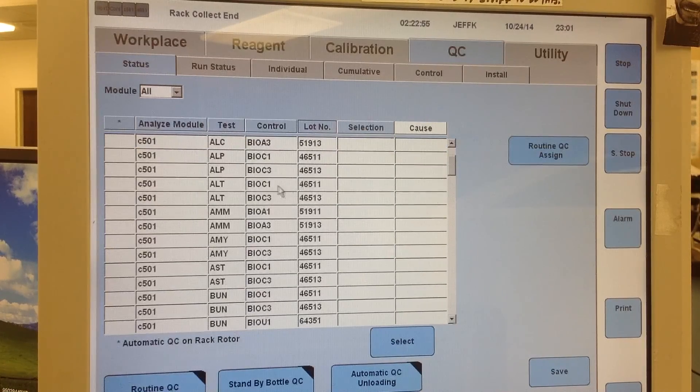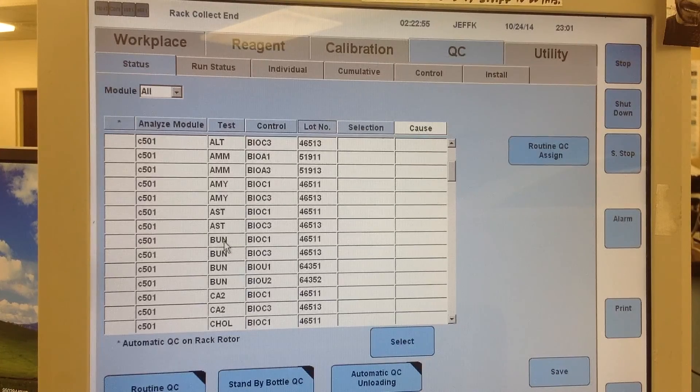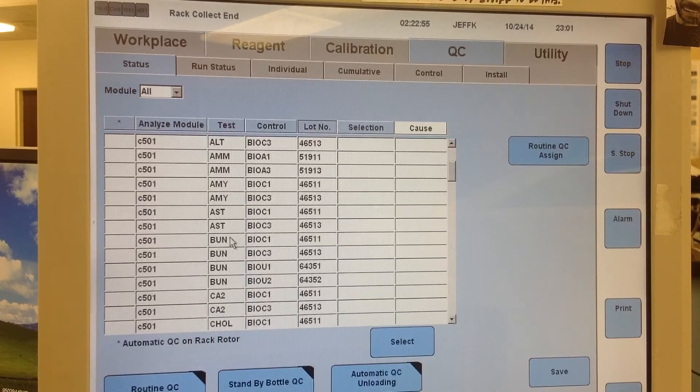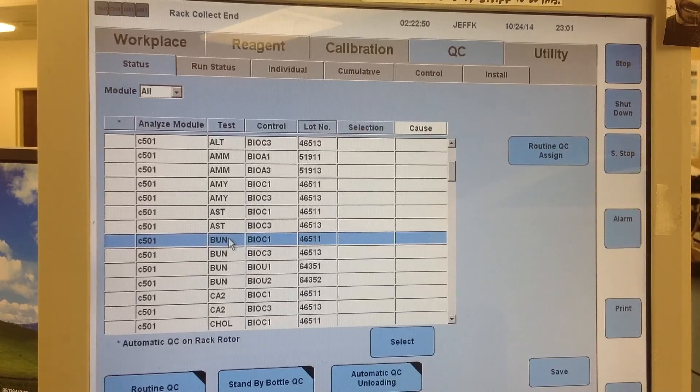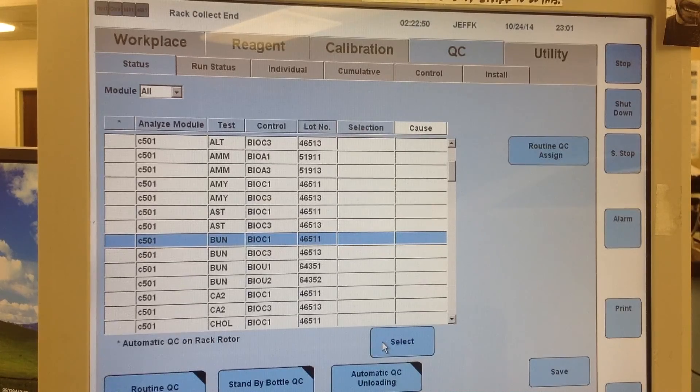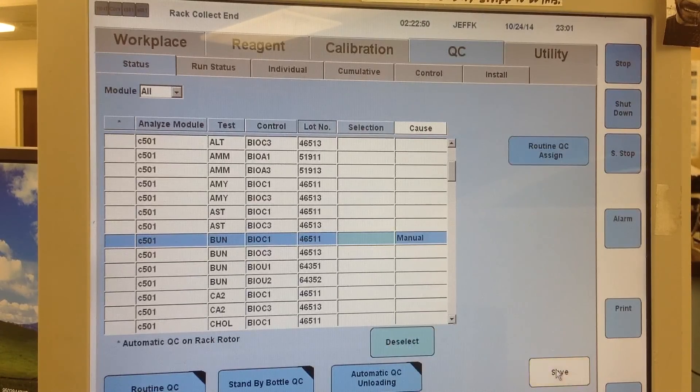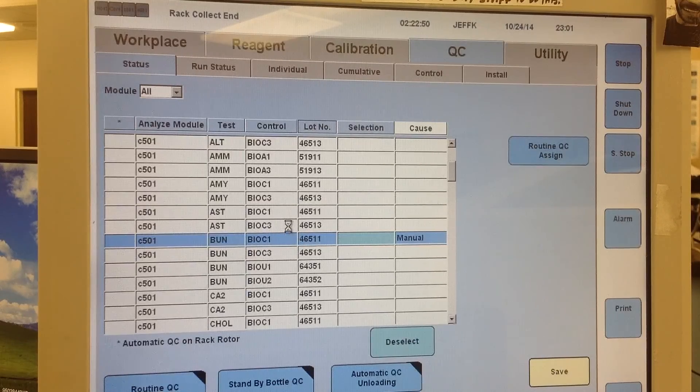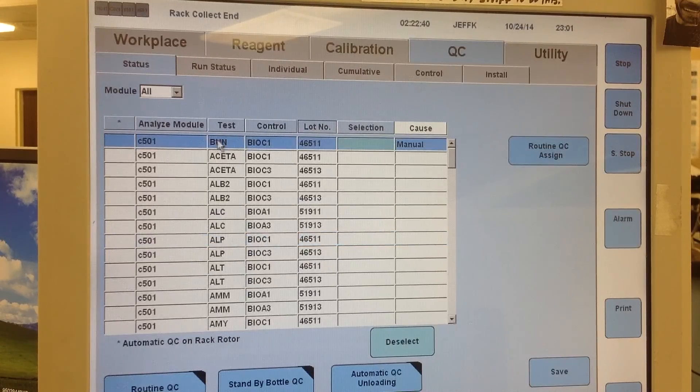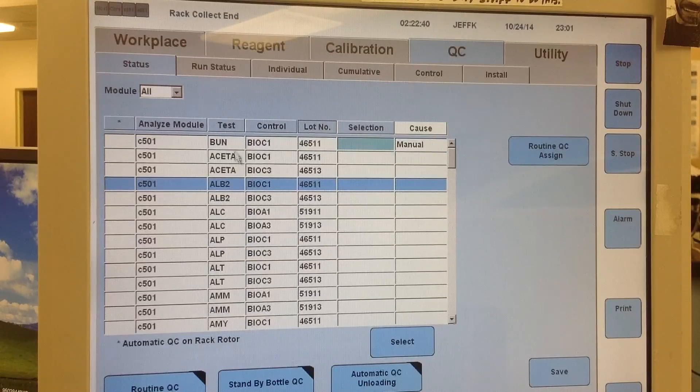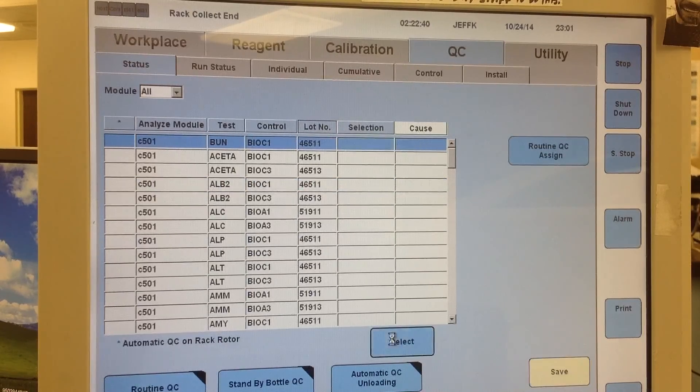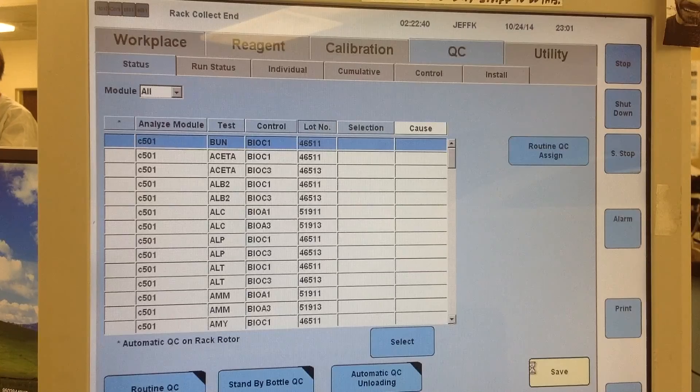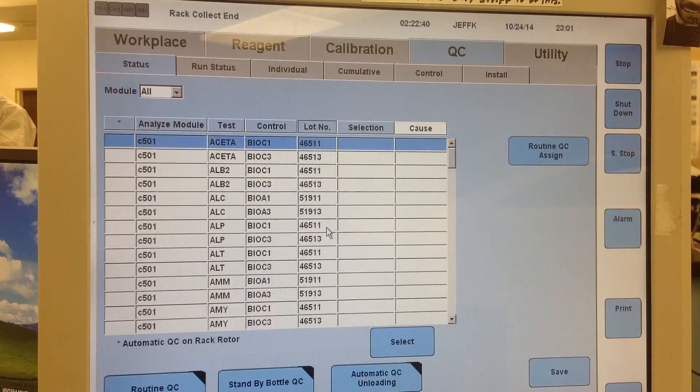So let's say that the BUN on the Chemistry 1 was out. You would simply select the QC that you want, click down here select, and then you would want to save it, and that would order your QC. Now let's say you decide that you don't need it anymore for whatever reason, you can hit deselect, save, and then that would unorder the QC.